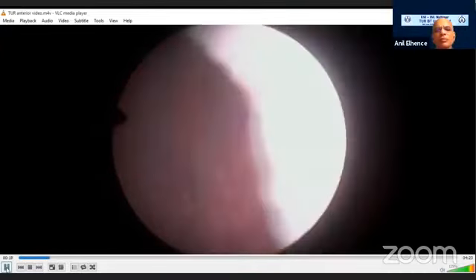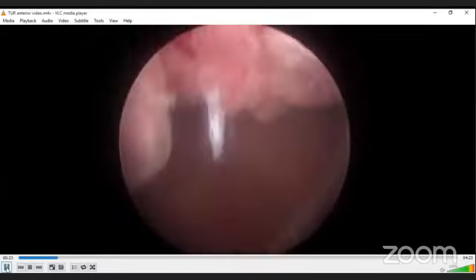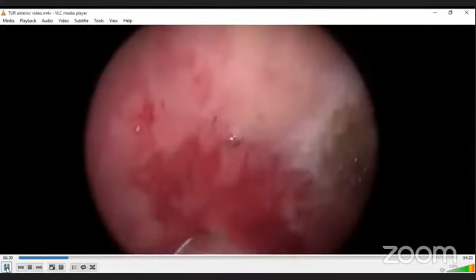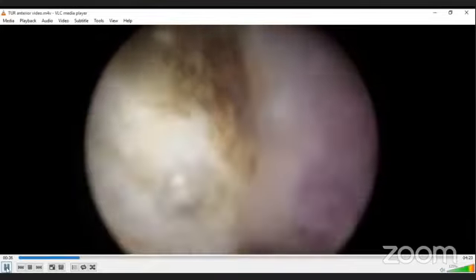Anterior bladder wall tumor. After I think straight away I'll go on with it. That is the tumor. It is slightly big in size in this particular case, which we had recorded shortly. And if the tumor is big, as the talks earlier have been given, there should be adequate imaging.